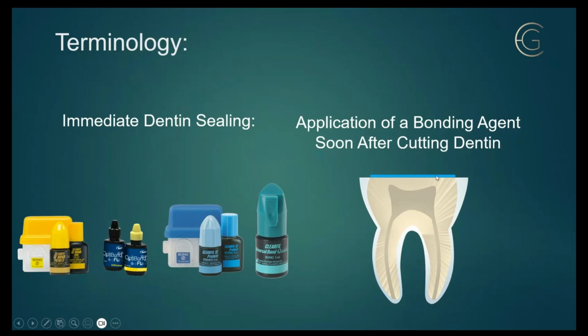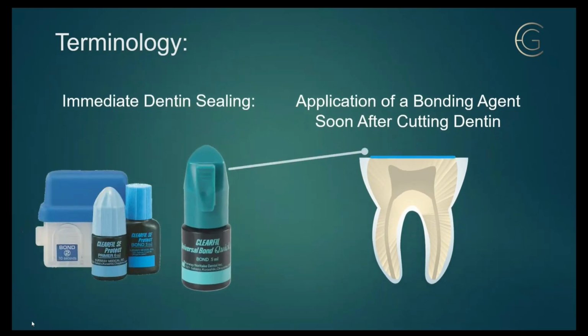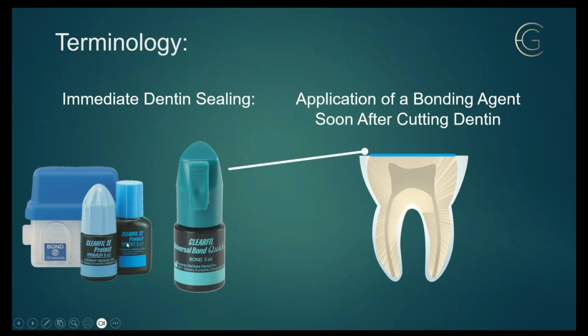So basically, on fresh cut dentin, after you cut and you're ready, you have to apply this within 5 to 10 minutes. Okay, so make a note of that. You can choose to stay with the 6th generation. This one has a built-in well. It has a thickness of 3 to 5 microns, and it has 3 different catalysts and polymers. One is self-leveling, or prevents pooling, I should say, immediate bond, so there's no waiting, and you gently air dry.